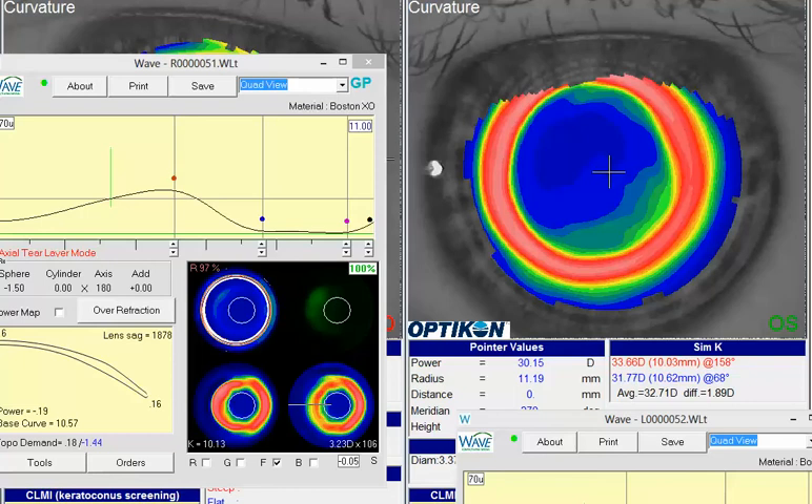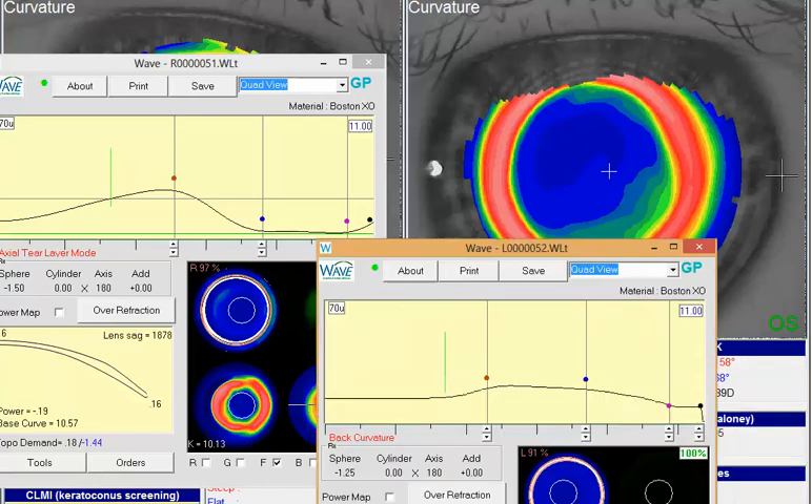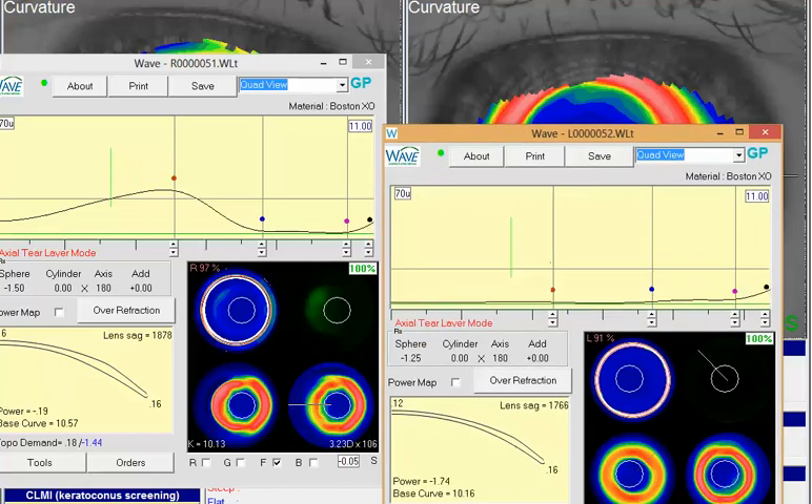So I would probably go for an approach of about an 11mm or more diameter lens — try to get it as big as you can get away with. That'll help stabilize the lens on that cornea and keep the comfort really nice. I went through here and just laid down those points based on where I could get them centered around that red steep zone, and that creates a really nice design for us.